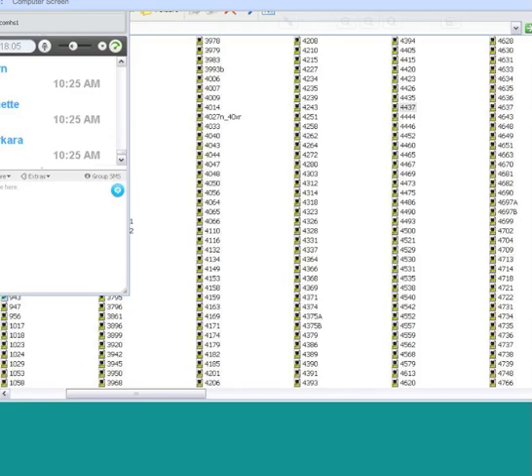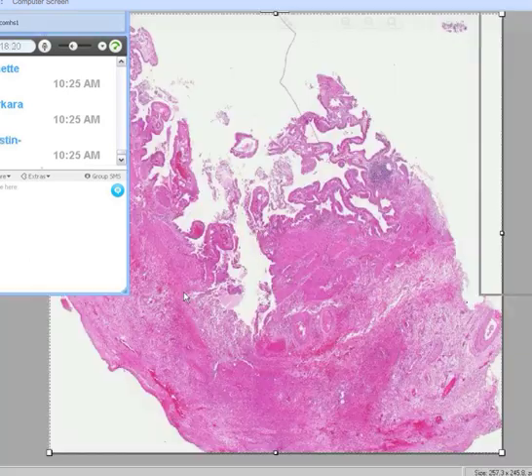Okay, let's do another one. This was easy. They're getting so easy now. We should probably just go home. We're so damn smart. Let's go to B33, which is over here. Okay. Jim, you don't count for being smart, but that's okay. You're smart anyway. You'll probably be able to pass the path boards by the end of this, even if you just watch us and tape the show.